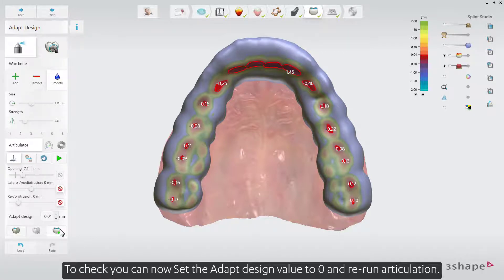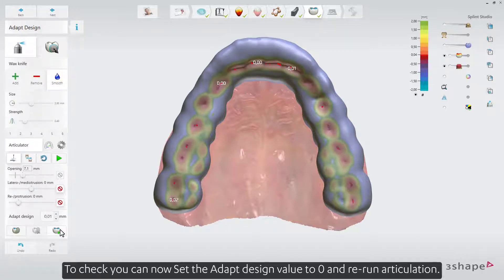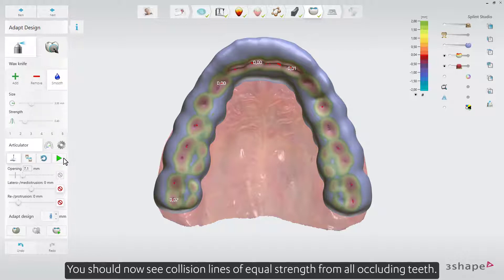Then press Adapt Design. To check, you can now set the Adapt Design value to 0, and re-run Articulation. You should now see collision lines of equal strength from all occluding teeth.